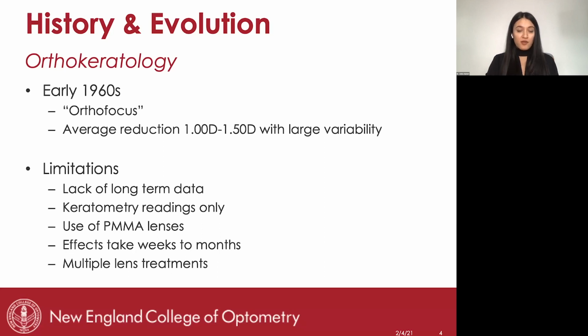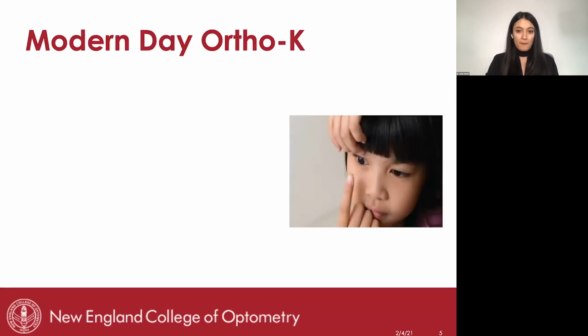Again, there was variability, and the timing would not be as predictable. And then the refittings would take multiple lens treatments. They would continue refitting flatter and flatter until the desired result was achieved.